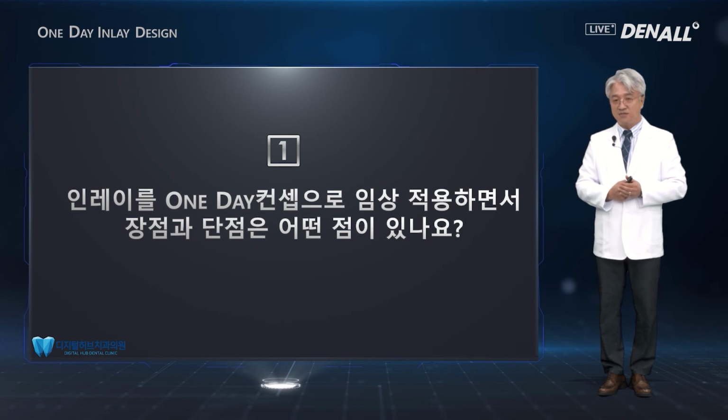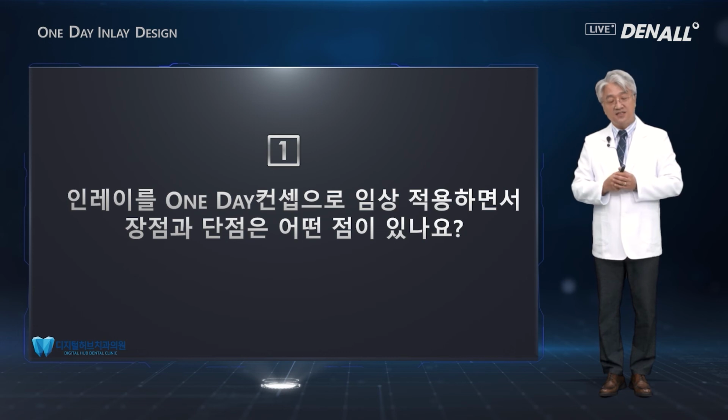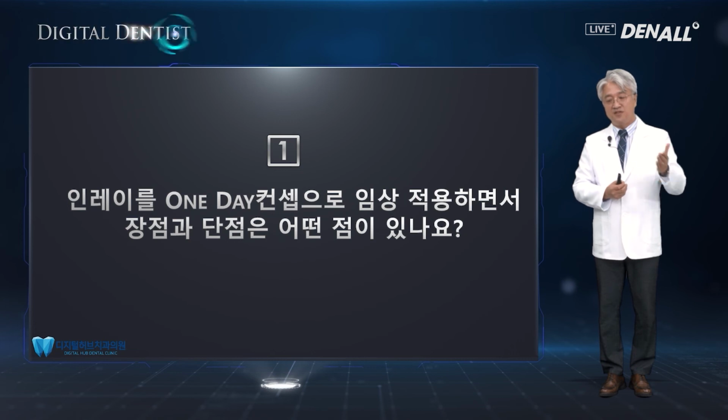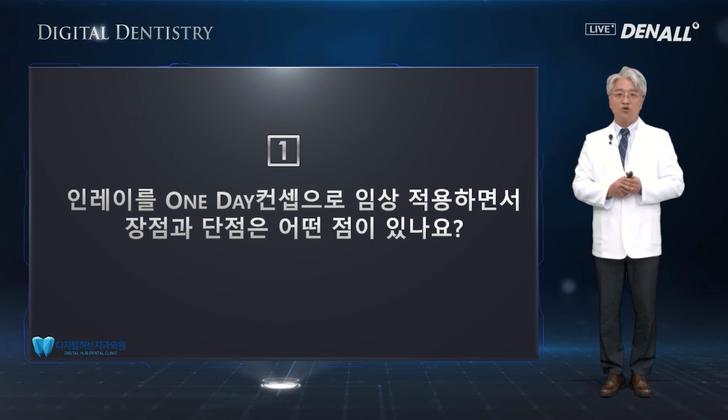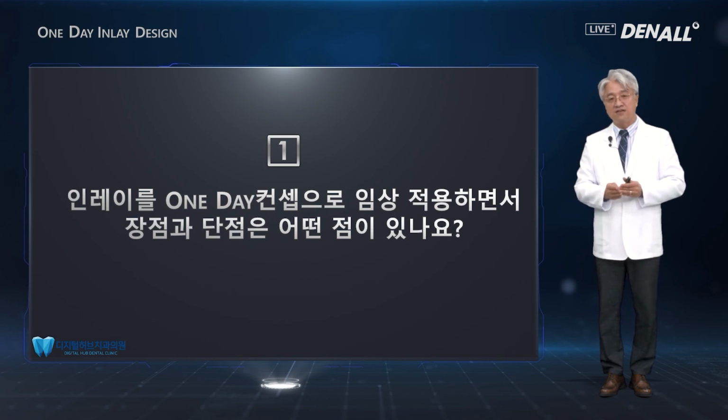But what are the disadvantages? First, resin printer or the milling machine or device, when you use the all ceramic or hybrid resin, all these materials strength, there's room for improvement. And secondly, actually inlay, if you make it with the CAD/CAM, then devices that you didn't need before, like milling device or scanners or design softwares, are now needed.